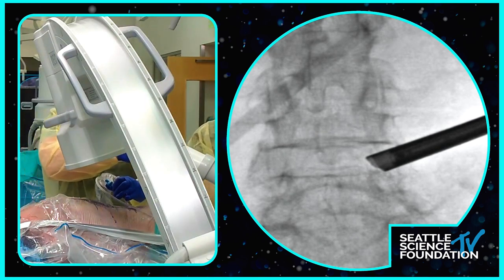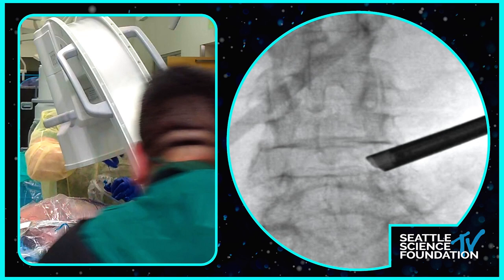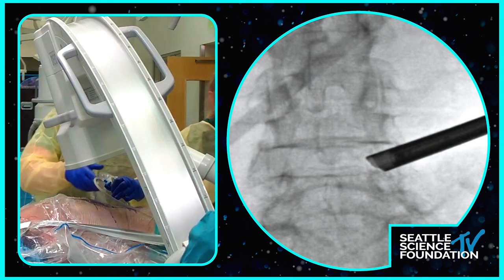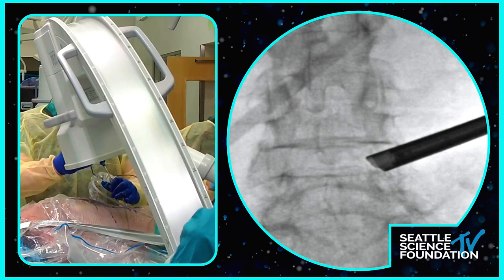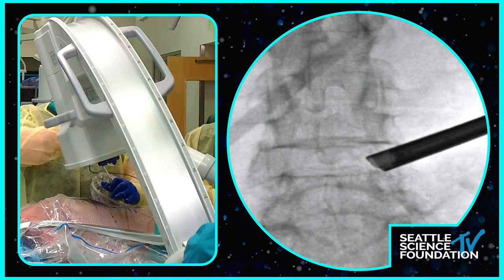So Ray, what's your workflow? Are you doing this discectomy blind initially and then verifying with the endoscope, or are you just doing a combination? What's your workflow for the discectomy? I like to get a pathway cleared out under direct visualization, get my annulotomy and get basically a cannula docked in the disc space, making sure that I'm protecting the nearest root. Each implant company has their own sort of equipment, and each endoscopic company has their own sort of equipment that you use to do your discectomy, so there's some variability there. So kind of whatever you're used to is typically what you're going to use.